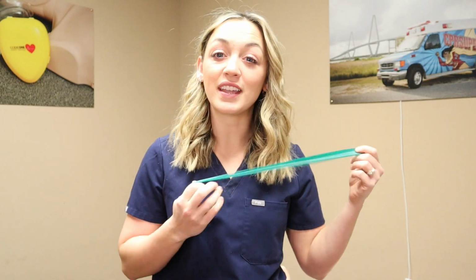Now remember, for your adult patients, never place an IV site on the same side as a dialysis catheter that is still currently being used for dialysis, and never place an IV site on a side of somebody who has had a mastectomy on that side. At the hospital I used to work at, we actually used to place pink bracelets on those arms, and that would tell us never to use that arm for anything. Alright, so let's change screens and I will show you how to place this on an adult patient first.